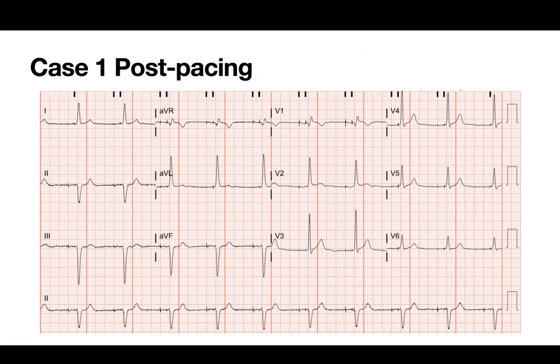So if the atrial lead is already there, there's another advantage of having it there. You see where the bottom part of the tricuspid annulus is. You know the anatomy very well when you're going in LAO and RAO, so it's very helpful. When I have a case of complete heart block or baseline left bundle branch block, I always put the atrial lead into the RV first and then start the case.